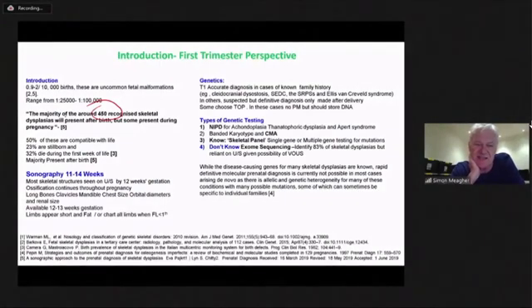And in the first trimester, we certainly struggle with these skeletal dysplasias that Sahar and Aris have covered so eloquently. Where our strength lies is more in the lethal, in a small group of the lethal, but more in the focal, because the proportion of fluid to limbs is much greater than in the second and third trimester. And therefore, in terms of picking up focal anomalies, we certainly have improving detection rates.